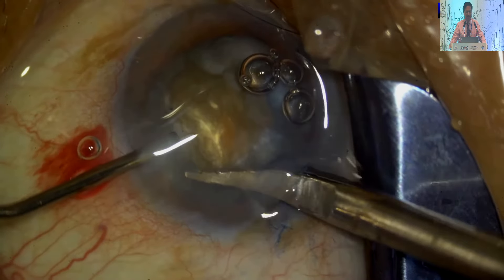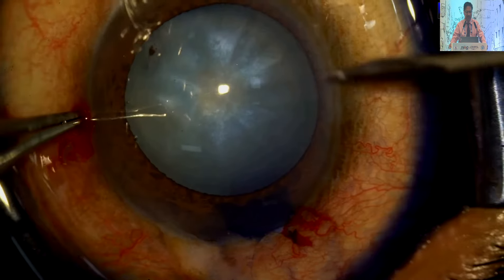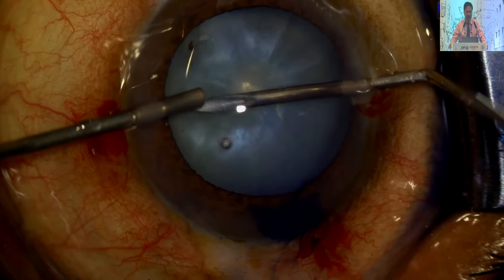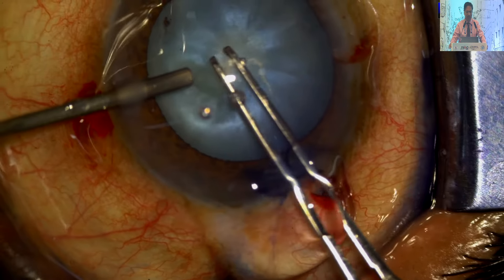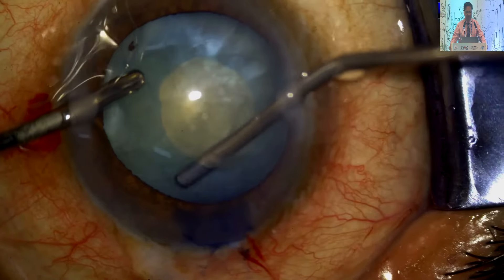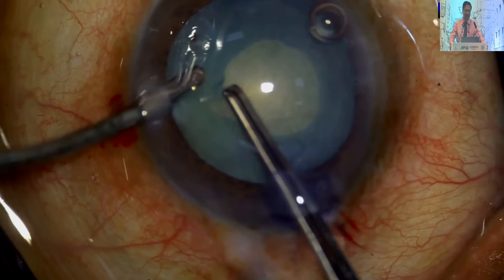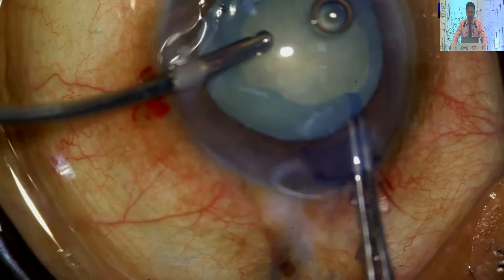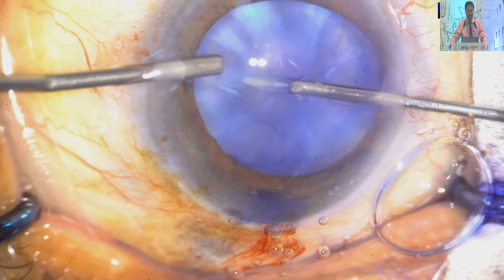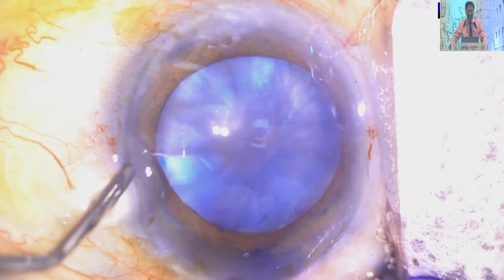Now this is the second stage capsulorhexis. Again the same technique — two side ports, aspirating central cortex, decompressing the capsule, and pouring viscoelastic from the other side. This is the main important point in this technique. Many people tried puncture capsulorhexis and other techniques, but what I found is the peripheral part is not taken care of, and many times you get Argentina flag sign — it will only decompress the central part. This aspiration combined with pouring visco from the other side will save your procedure.